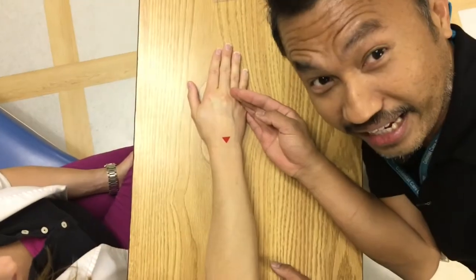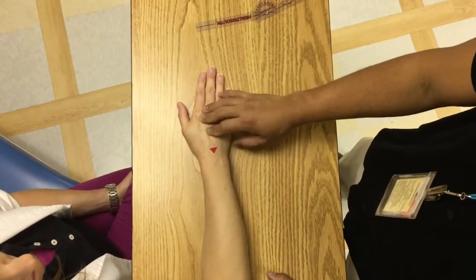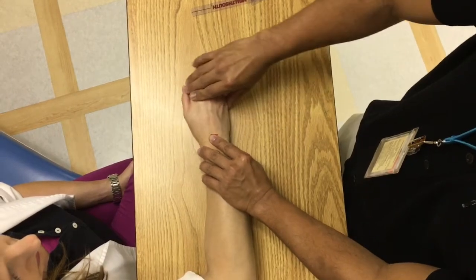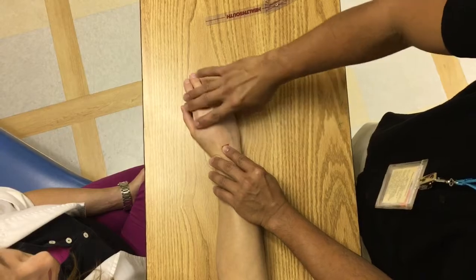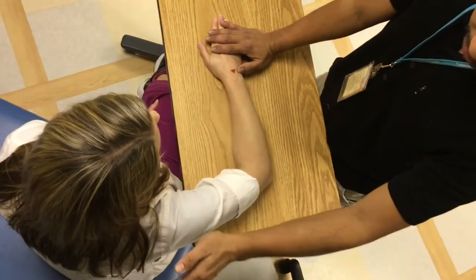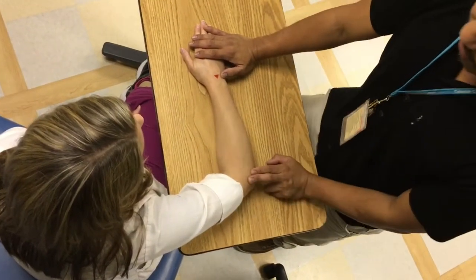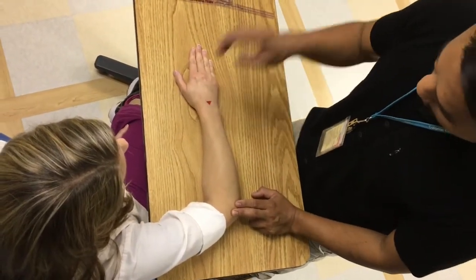Thank you. So I'm gonna show you how to measure radial deviation and ulnar deviation. This is ulnar deviation, and from this position, move that way, that's the radial deviation. First, we need to put the patient, the person, in a seated position with the shoulders abducted 90 degrees and the elbow flexed 90 degrees as well. And then the next step is to find the bony landmarks.